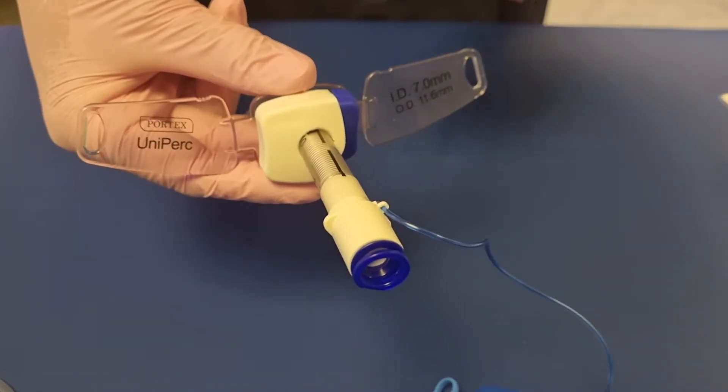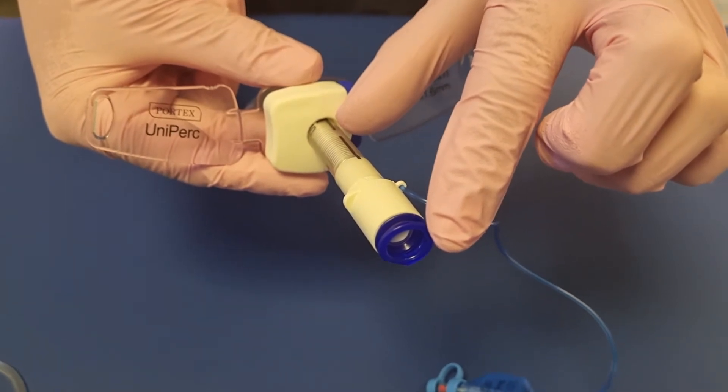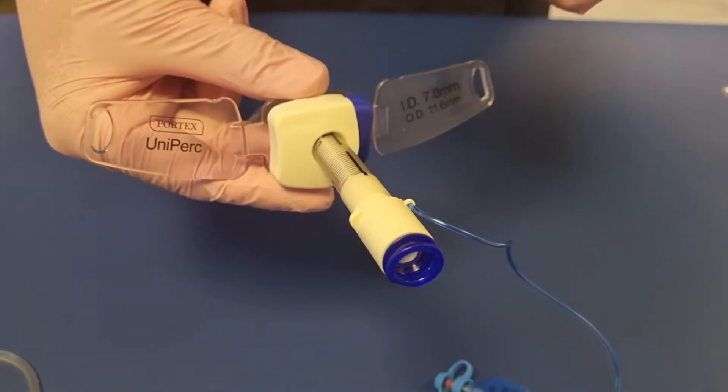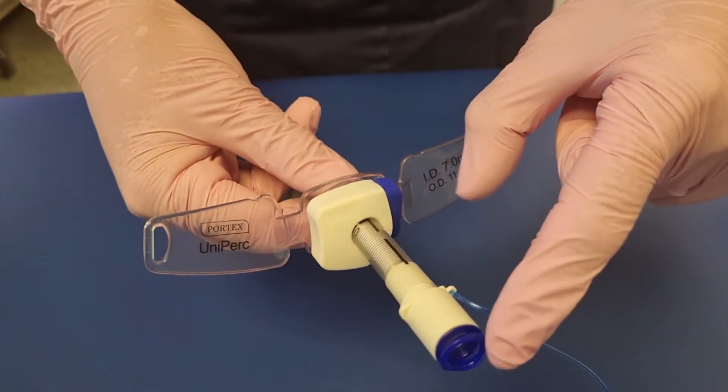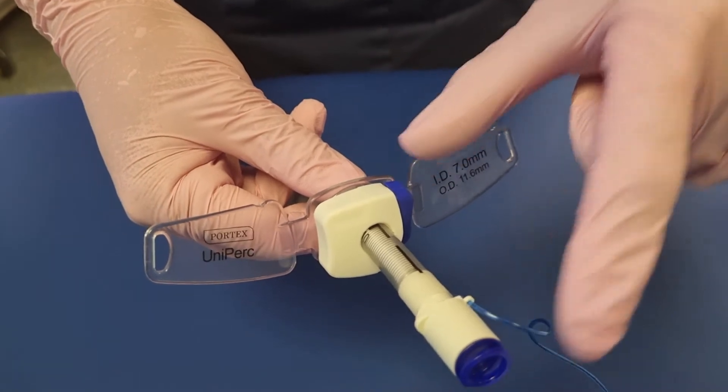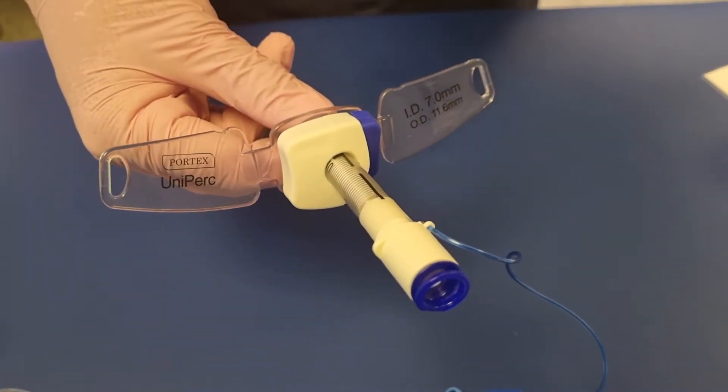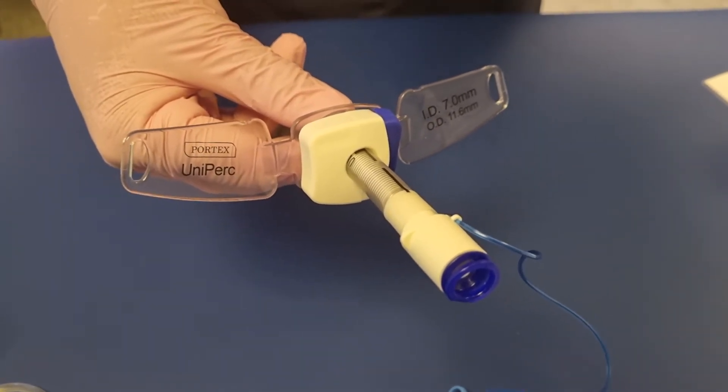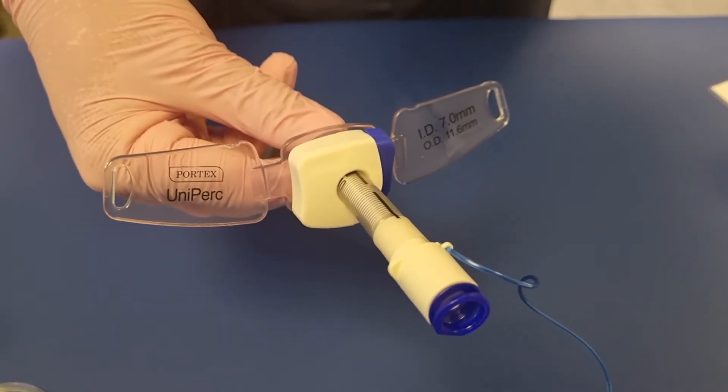The ENT surgeons should always measure the distance between the end of the tracheostomy tube and the securing part. So the surgeon should measure from the end of the tube to the securing clip, and that point is always put in our records to ensure that the adjustable flange tube is kept in the correct position whilst it's in the patient.